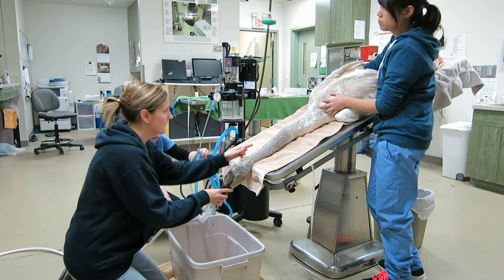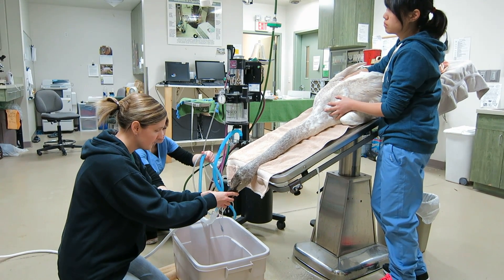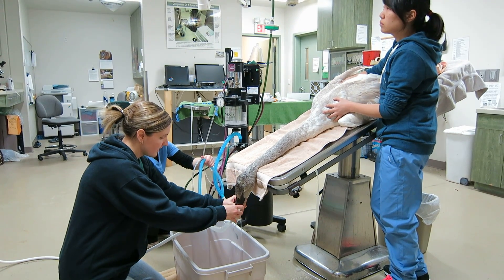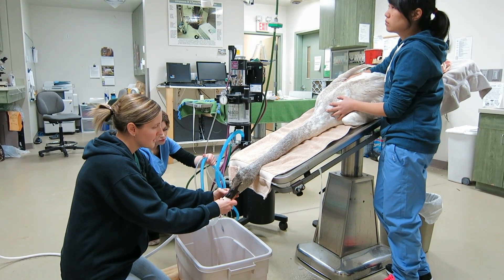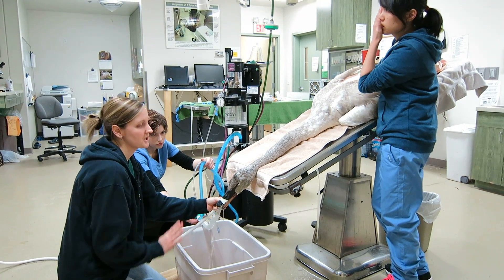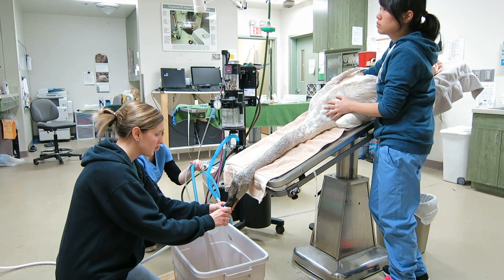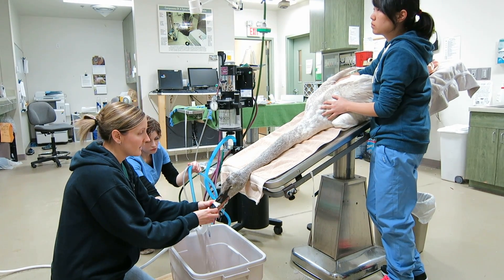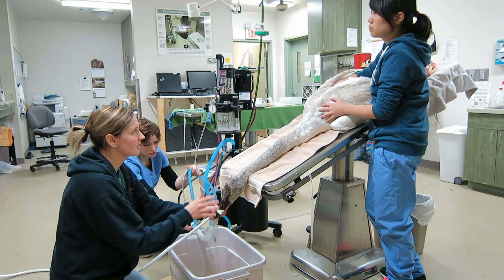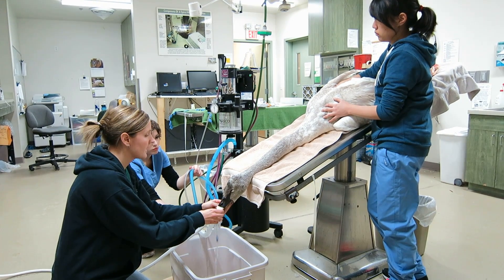They have a very long esophagus, so we need a long tube to get all the way down into the stomach. One thing we have to be really careful of is watching the heart rate and respiration of this bird, because we're pushing a lot of water into its body. That can activate part of their nervous system and cause their heart rate and respiratory rate to drop, so we need to make sure the bird doesn't stop breathing or go into cardiac arrest.